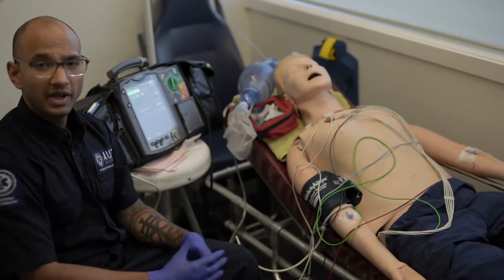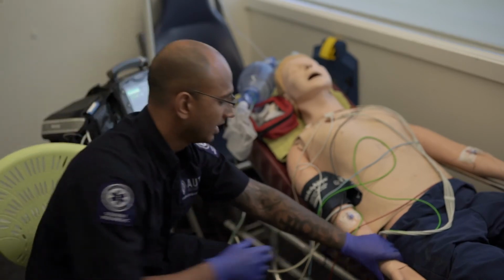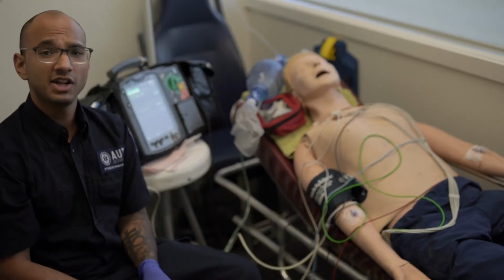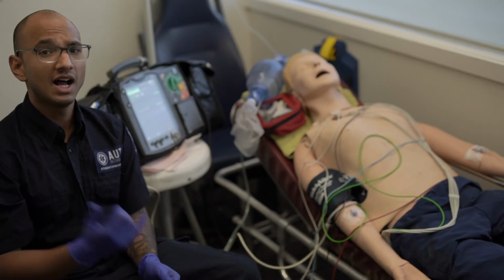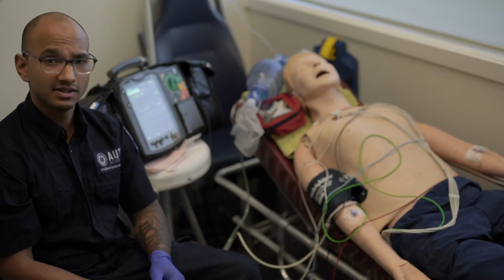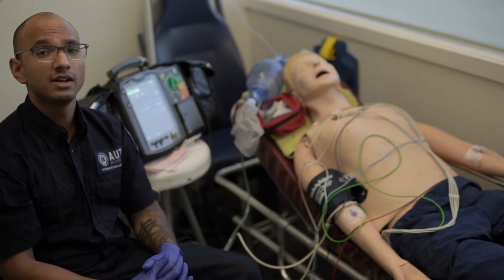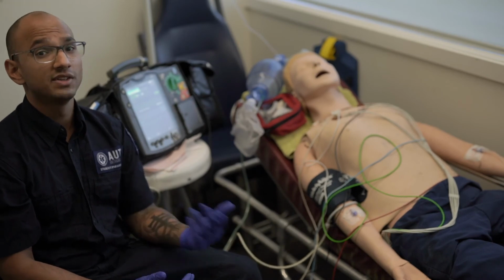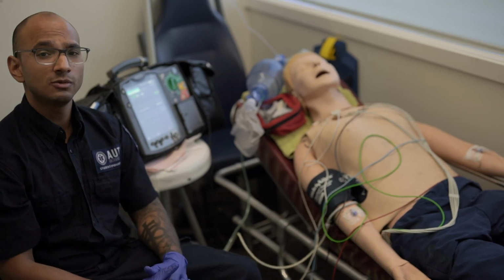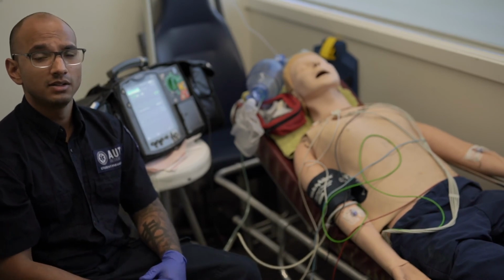Now, as our patient still appears to be significantly compromised and is still unable to obey any commands, we will now begin transport to hospital and request R50 backup en route, as our patient has been unsuccessful with electrical cardioversion and may still require chemical cardioversion, which is an ICPS skill, not a paramedic skill. En route to hospital, we will radio call in and make our way.